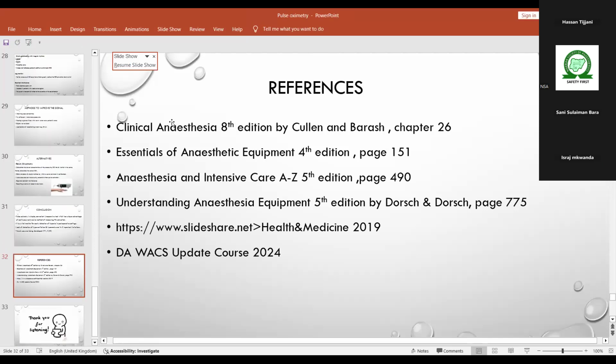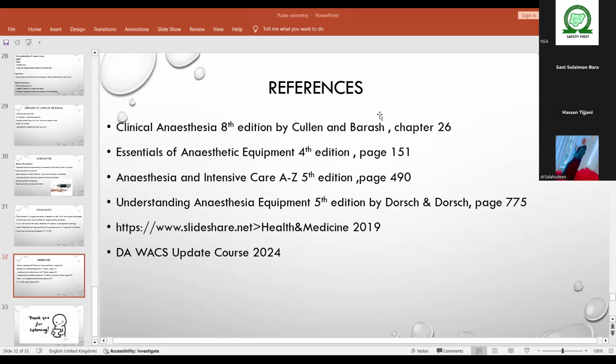Thank you very much for your presentation. Please, I would want the presenter to speak about the factors that affect pulse oximeter readings, and then the factors that do not affect pulse oximeter readings. And then I also want to know if we can actually rely on the pulse oximeter reading in a neonate, in an infant below 6 months with hemoglobin F, since we know that the readings of the pulse oximeter were actually obtained using adults as the study population. So can we rely on that? And then in my environment, we use this pigment we call lele in Hausa. Does it really affect the pulse oximeter reading as well? I want to know. Thank you very much.